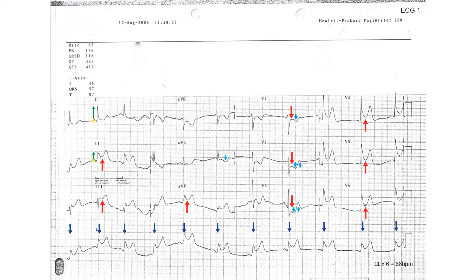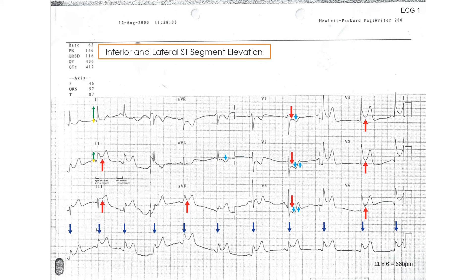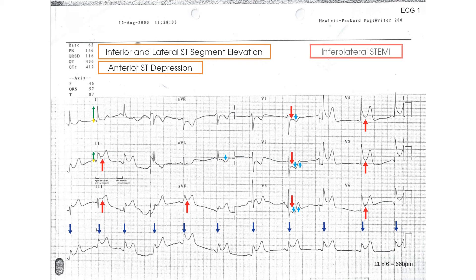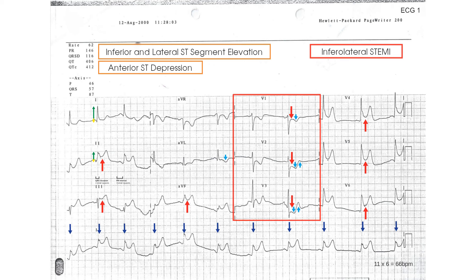In summary, this ECG recorded from a patient with chest pain shows ST segment elevation in the inferior and lateral leads and ST segment depression in the anterior leads. It therefore shows an inferior lateral ST segment elevation myocardial infarction, an infralateral STEMI. It is possible that the deep horizontal ST segment depression present in the anterior leads associated with T wave changes and a dominant R wave in V3 represents posterior extension of the myocardial infarction.